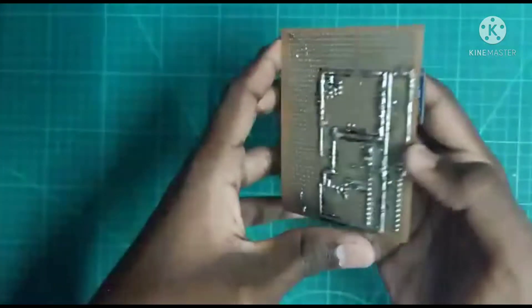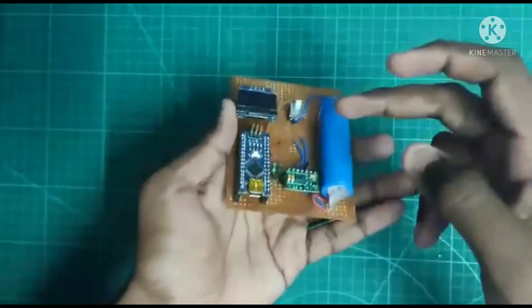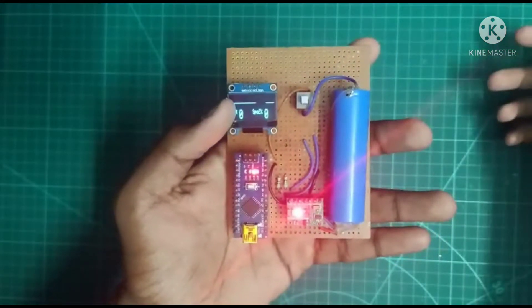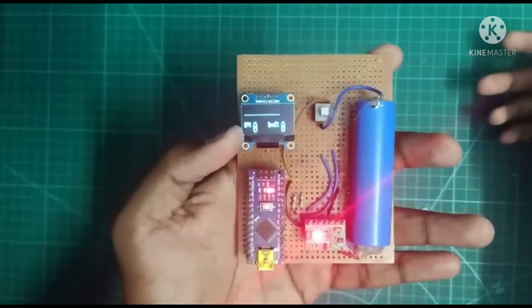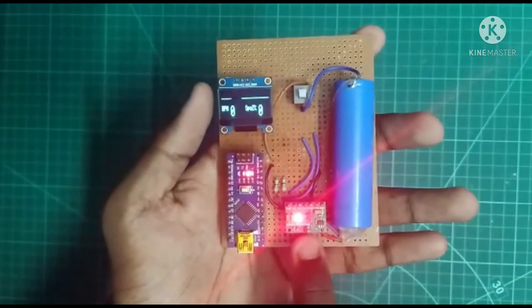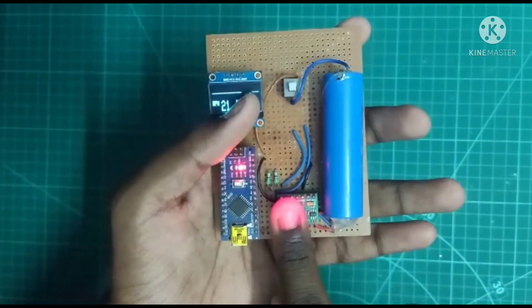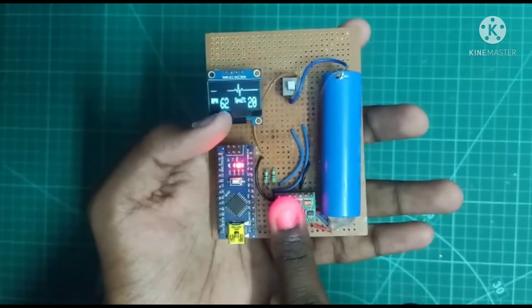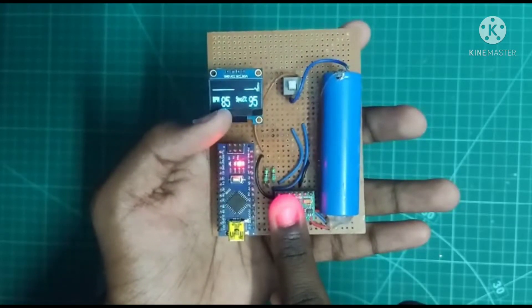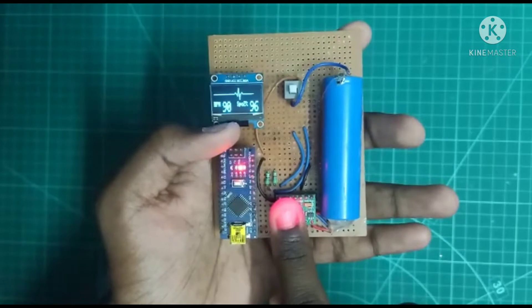This pulse oximeter is very essential to us in this pandemic time. Let's turn on the switch — after turning on it will show the pulse oximeter display like this, and some lines will appear. BPM means heart rate and SpO2 means oxygen saturation. We can see on the pulse sensor there is a light; we need to keep our finger on the light. After keeping the finger, you can see waves on the display and values: BPM is heart rate and SpO2 is oxygen saturation.